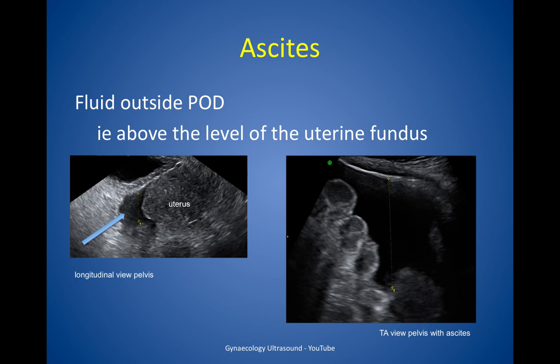Shadowing: it's important to look for shadowing — we've become rather used to ignoring shadowing as artefact, but when describing an adnexal lesion it's very important to look for shadowing. Ascites: the definition of ascites is fluid outside of the pouch of Douglas, which means fluid above the level of the uterine fundus. On the right hand side you can see extensive ascites on a transabdominal view of the pelvis.